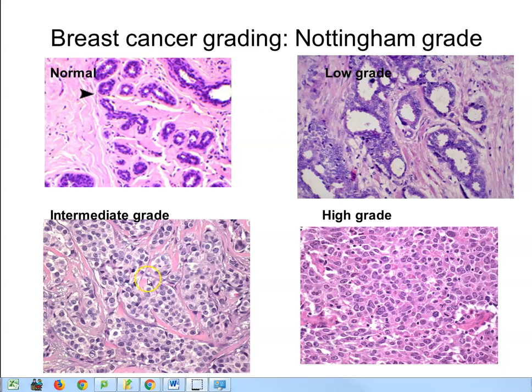As we move through to intermediate and high grade, you can see cells trying to form ducts but with very little stroma in between, and the ducts are filled with tumour cells. If we go to high grade cancer, it's just a mass of epithelium — I can barely see any stroma. All you have is a mass of tumour cells and blood vessels, so that would be a high grade cancer.